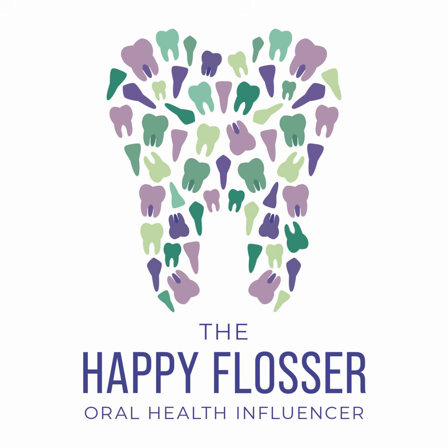Is it multilocular, where it has a bunch of little bubbles and looks like soap bubbles together? The location and the distribution of these lesions when you do see something is really important. And then how does the surrounding tissue around that lesion respond to what you're looking at? These are very important things for you to consider.